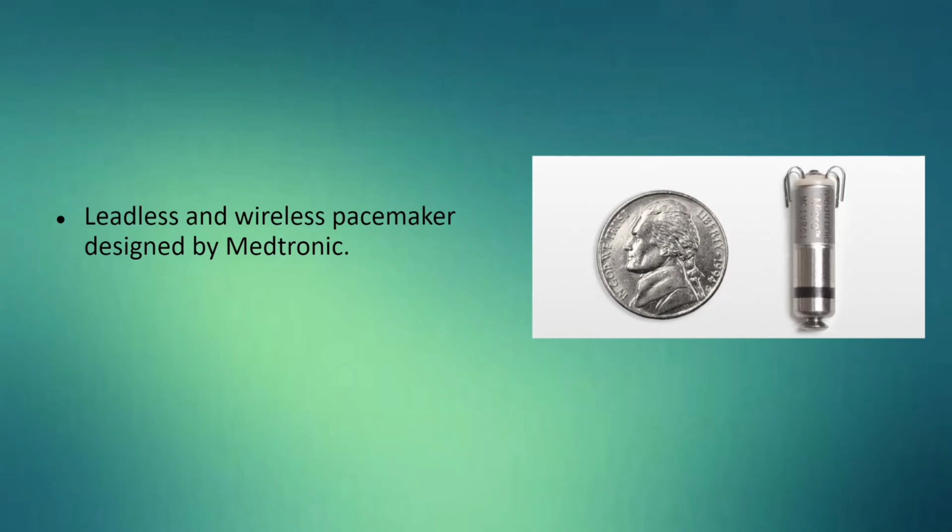So the last and I think the most important study is the development of the leadless and wireless pacemaker introduced by Medtronic. New leadless systems that can provide pacing to one chamber of the heart are now available.